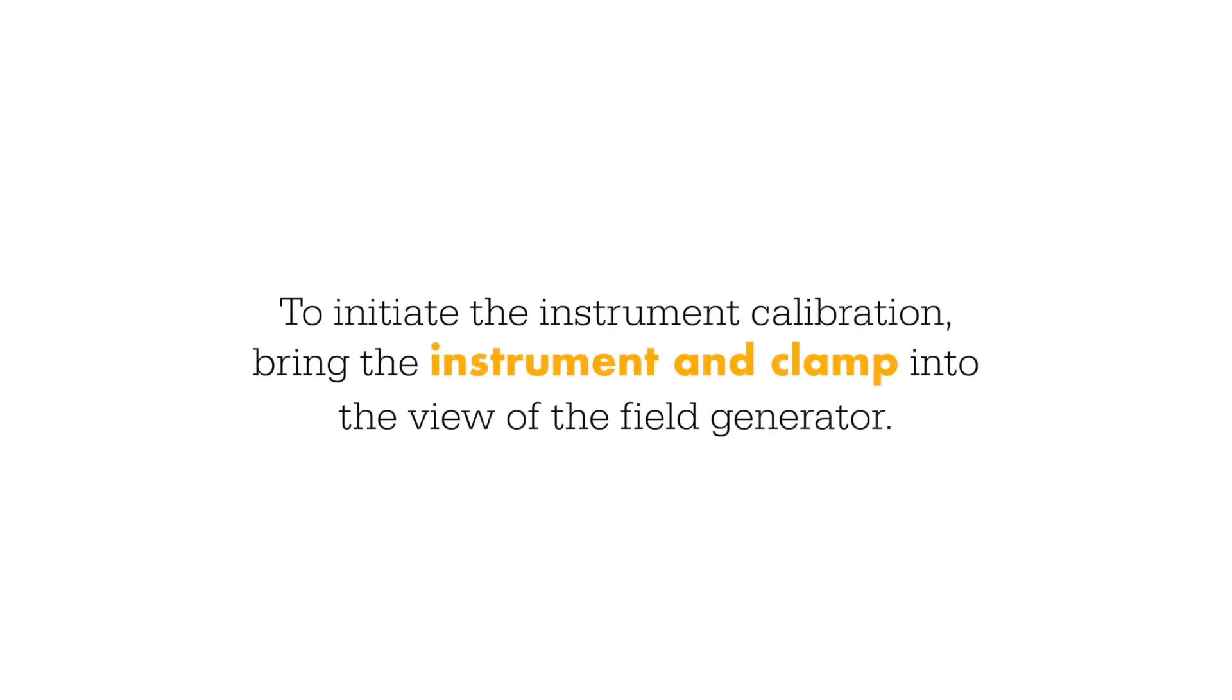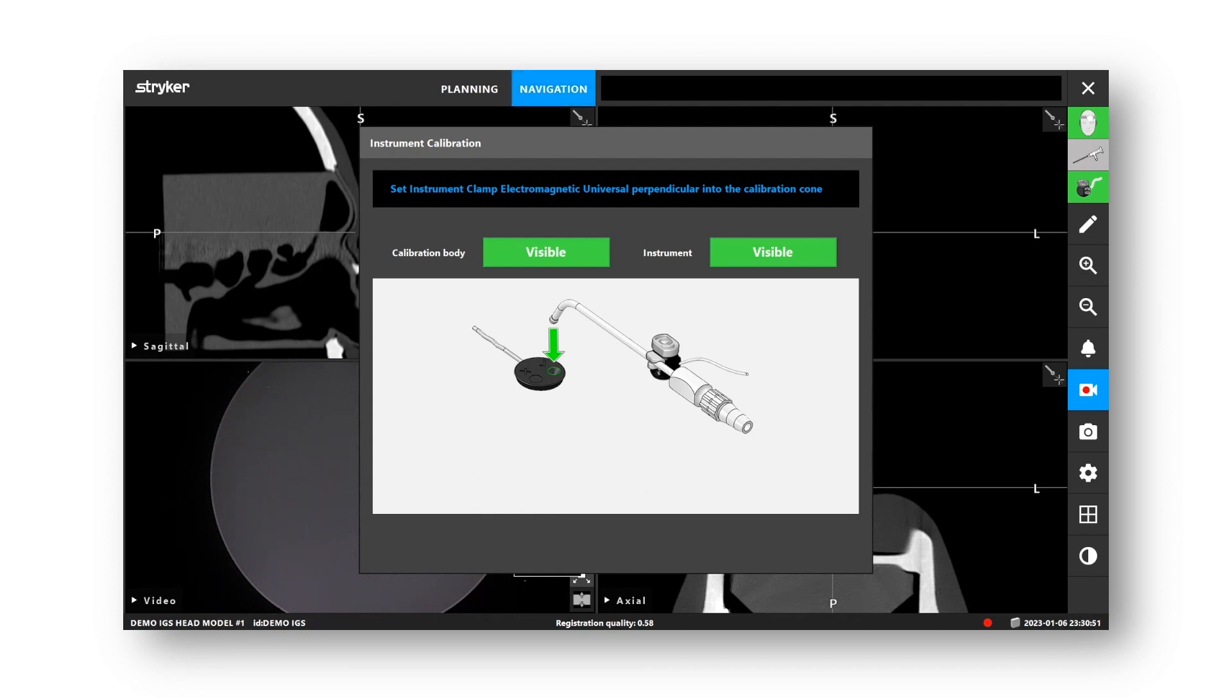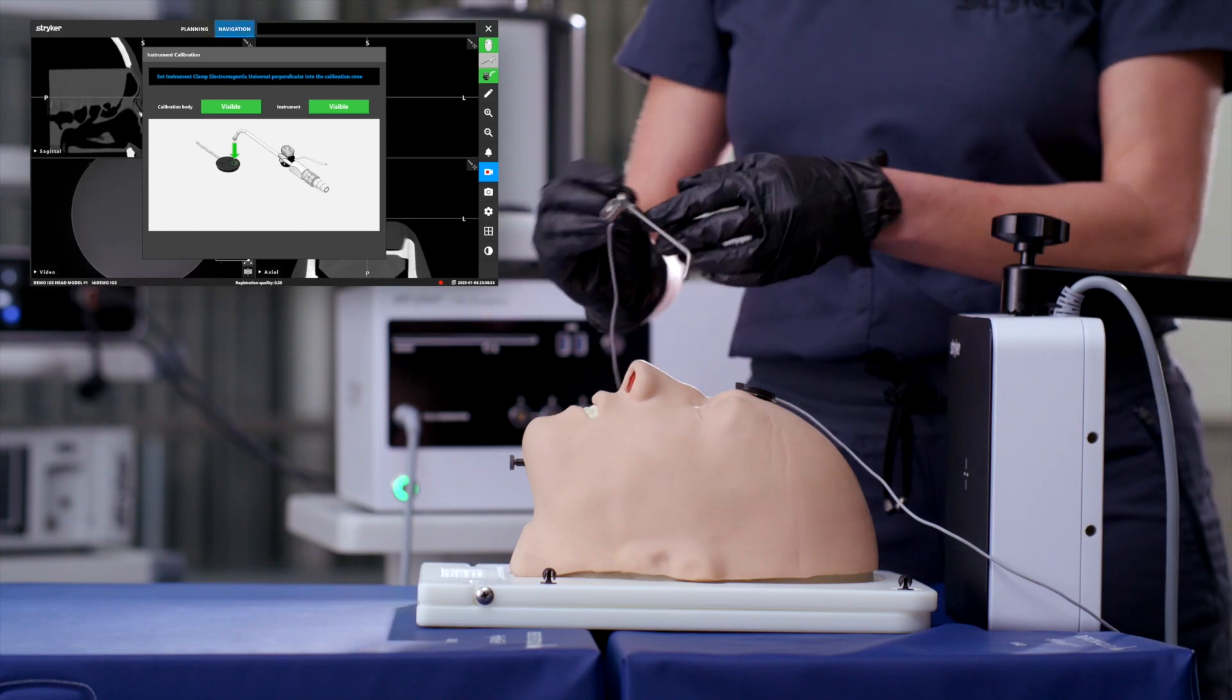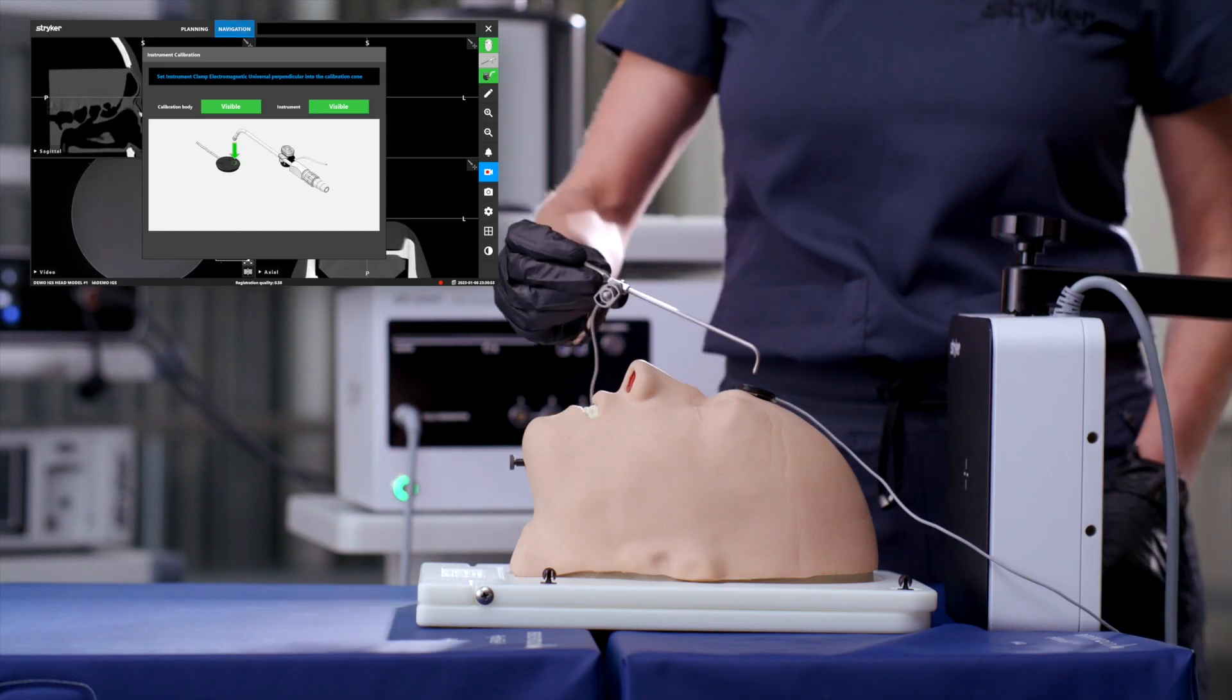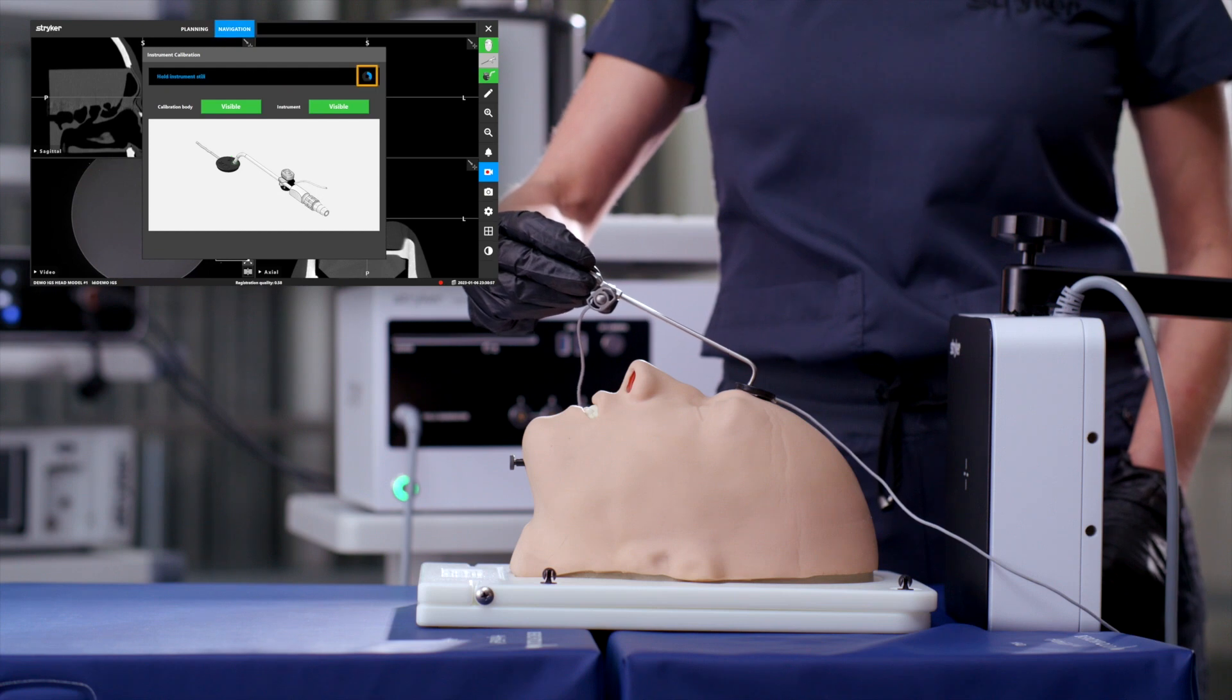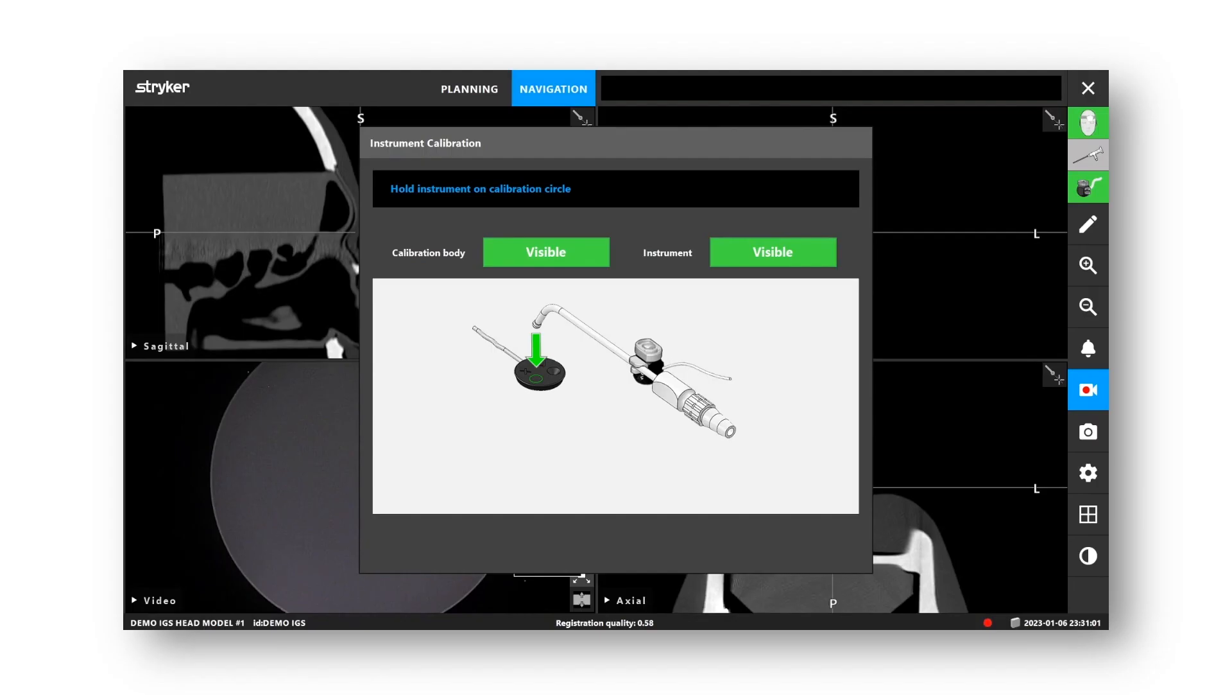To initiate instrument calibration, bring the instrument and clamp into the view of the field generator. Once the clamp is recognized, a dialog box will display on the screen that will provide visual instructions on next steps. Next, place the tip of the instrument into the cone on the patient tracker and hold until the software completes this step, indicated by the progress wheel in the top right corner and the confirmation tone.